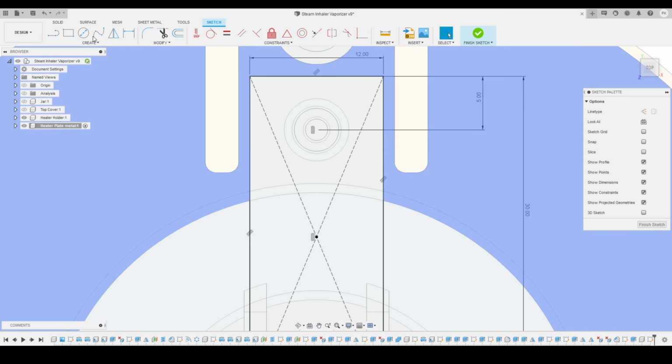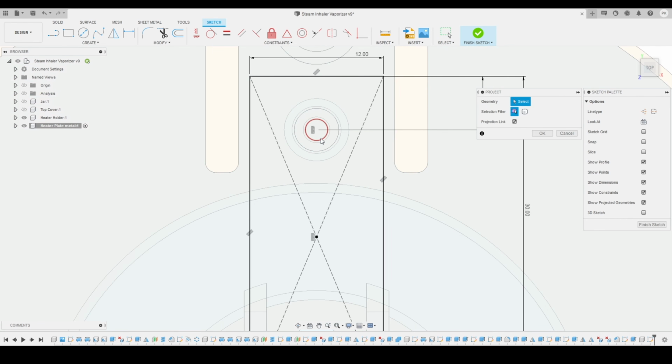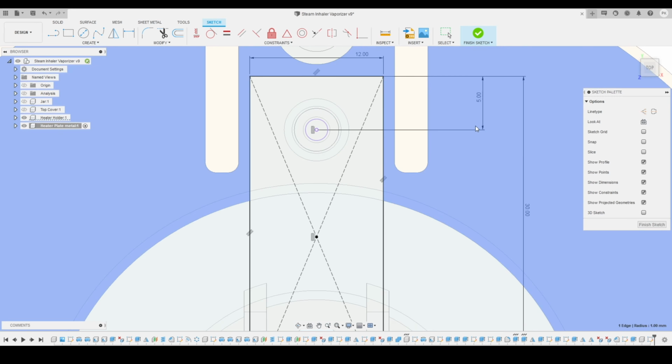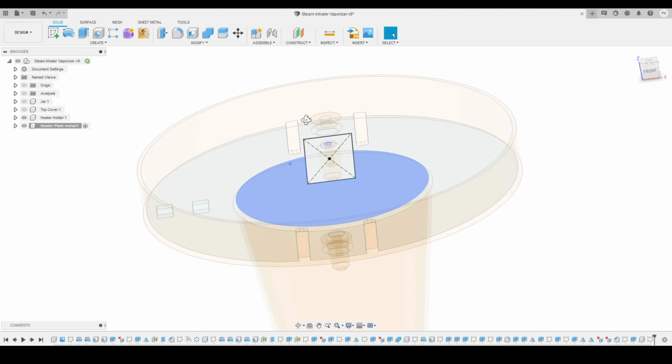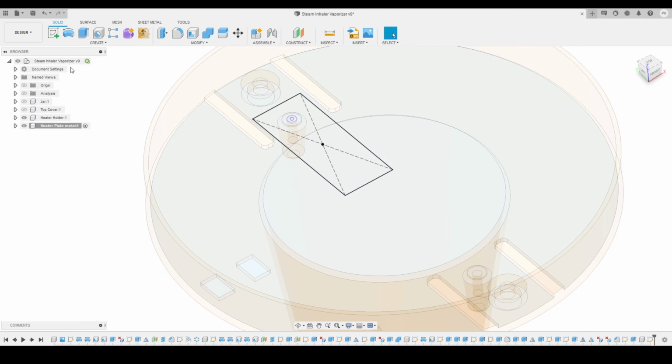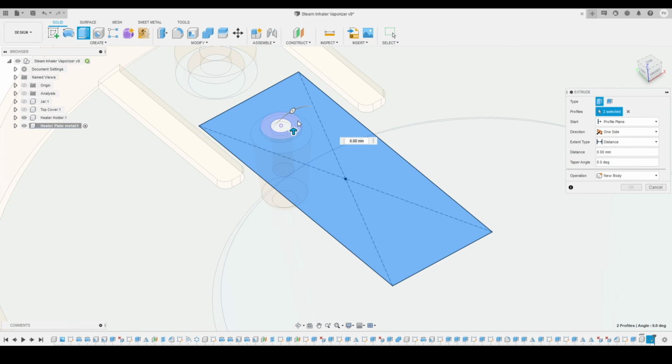And I will also project this circle, so for that I will just activate my project tool and select this entity that I want to project and press OK. Here you can see, this is for the hole to fix the plate on with the heater holder. Here you can see we had created it like this. We'll activate the extrude tool, select the profiles and extrude it.